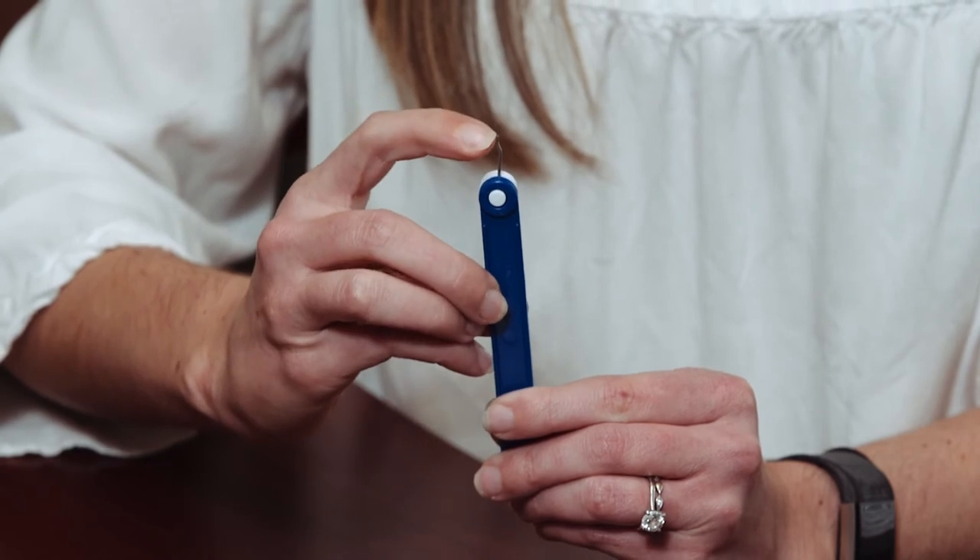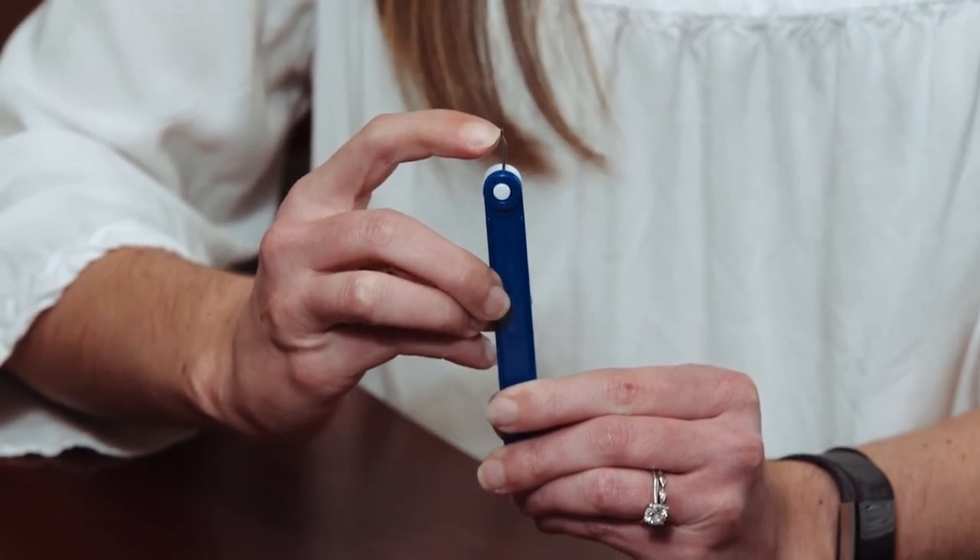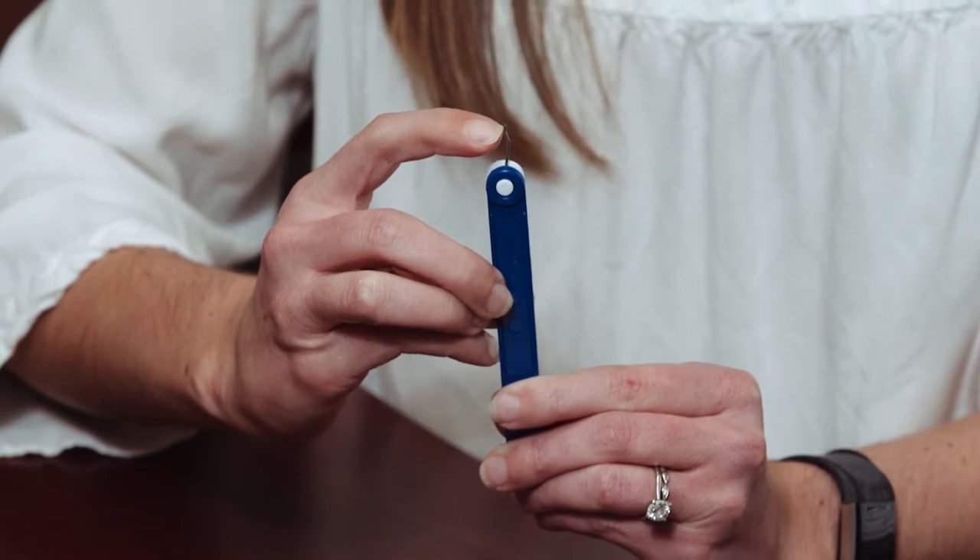Before we go over the steps I want to show you the expander key, which is the tool you'll be using. If you notice here, there is a small indention about a few millimeters away from the edge of the tool. This is where you'll feel it bottom out when you're making your turns.